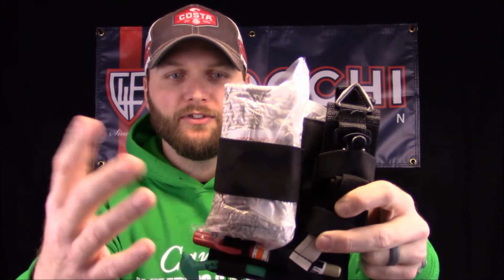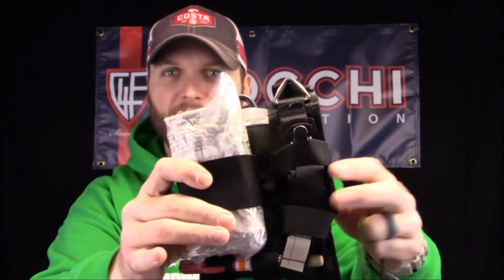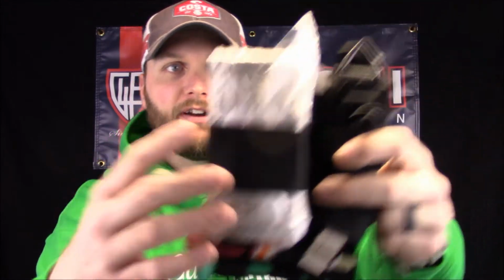So as you can see, you have the big pressure bandage here. This is an old Israeli bandage. Has a spot for a tourniquet. This is the soft T. You can also put a CAT tourniquet in there. My CAT tourniquet was a little bit loose. I would probably have to stage it a little different for it to stay in there very well. Also have a spot for a chest decompression needle and a nasopharyngeal airway. And then in the back little pouch here is a spot for a chest seal, which I have back there, and then I've just got a pair of shears thrown in there.